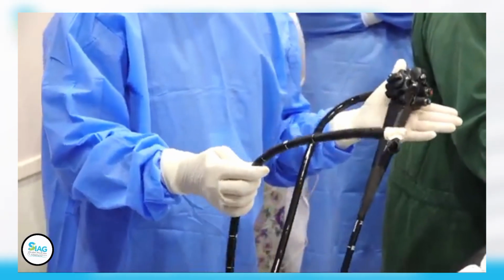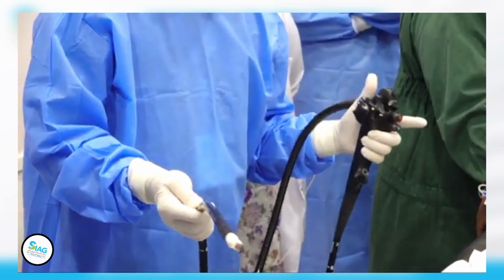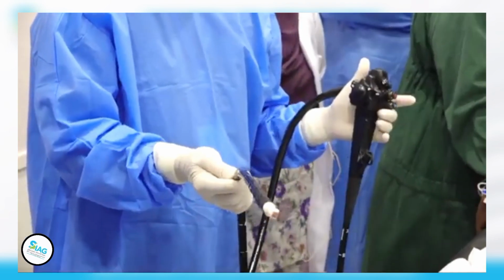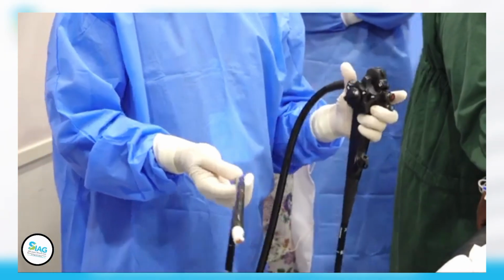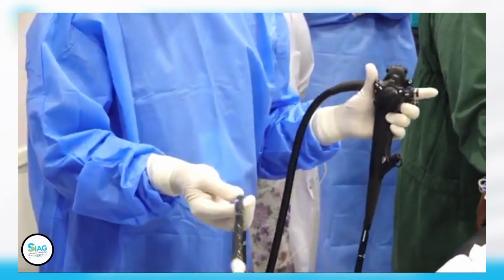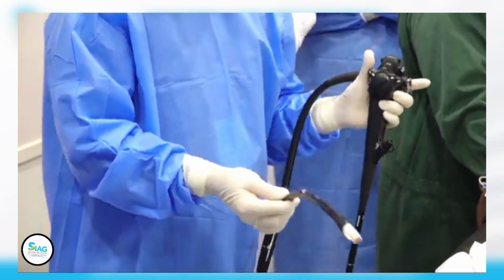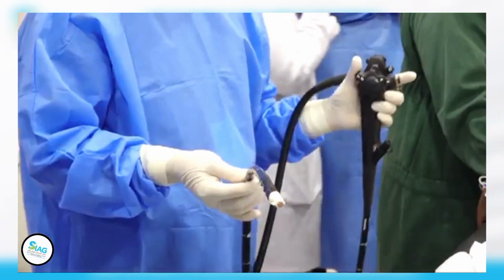With a linear scope, you may not need a balloon. You can do it without, but I prefer a balloon because it gives me a little better apposition to the wall, and especially if there is a diverticulum in the duodenum, it helps me with that. So I usually use a balloon, which we put on. Scope is working. So we'll go ahead and start.